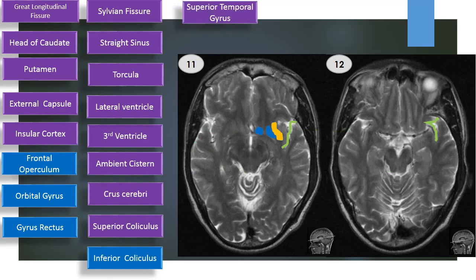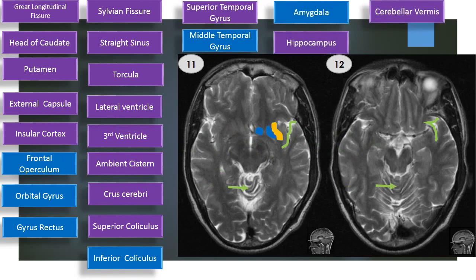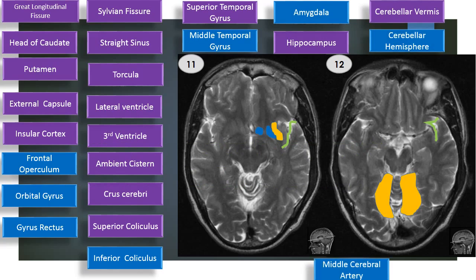Superior temporal gyrus. Middle temporal gyrus. Amygdala. Hippocampus. Cerebellar vermis. Cerebellar hemispheres. Middle cerebral artery. And posterior cerebral artery. Thank you.